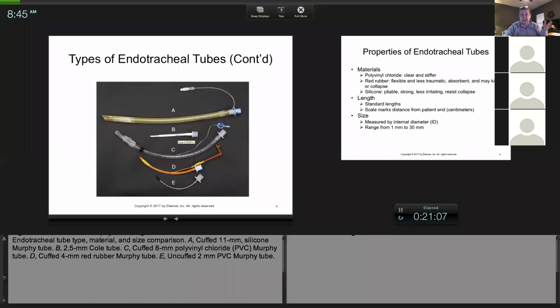And they did a study and traced it back. These cats were having a lot of coughing after surgery, and it was turning into more than just a couple-day cough. They were having a tracheitis, and these tubes had this chemical because they were soaking their tubes.